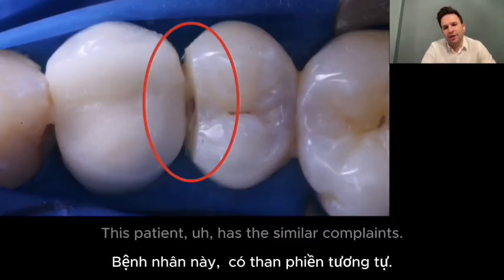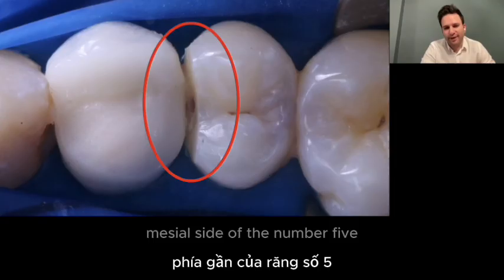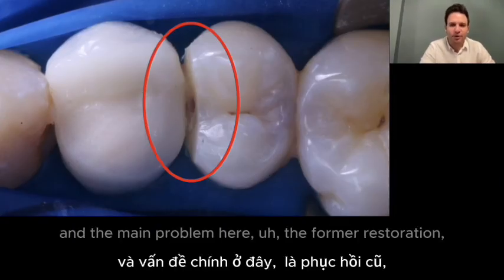This patient has similar complaints. He had food impaction on the mesial side of number 5, and the main problem here was the former restoration.